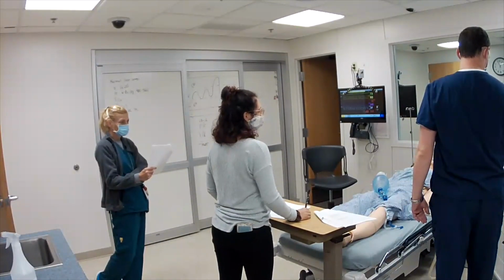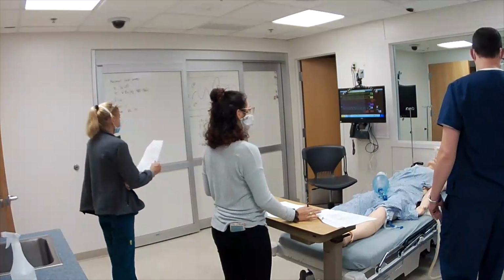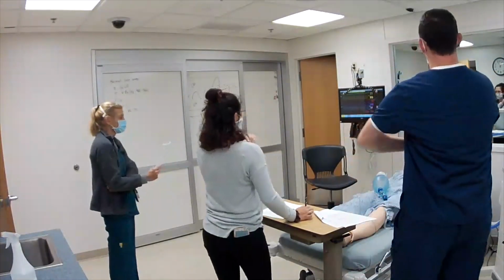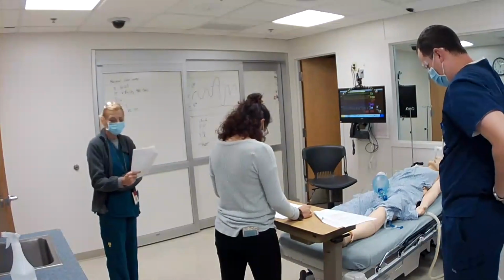Hopefully someone has their alarm set pretty good. Yeah, that'd be good. Maybe she's a respiratory therapist. Oh, she's smart. She's already changed the alarm. She figured that part out. I don't like her. I don't like her. She figured out she better turn down the alarm profile on there, so poor Stanley doesn't even know what's hitting him.